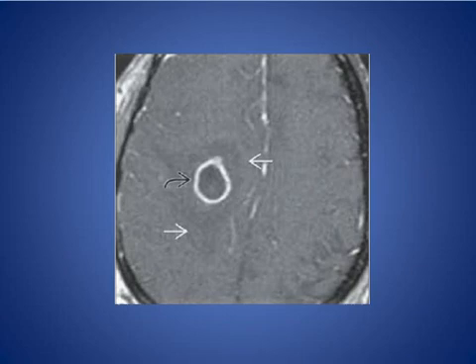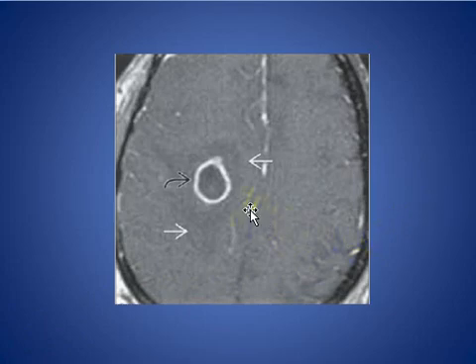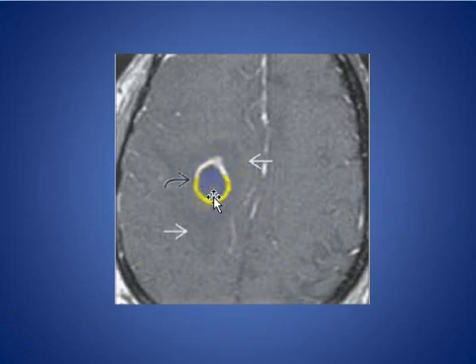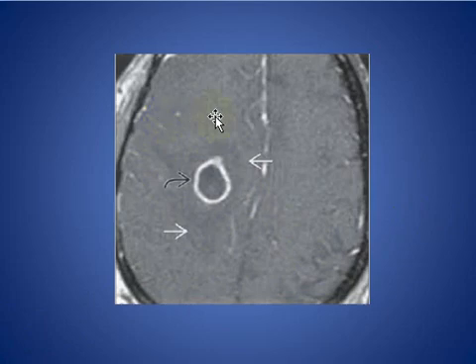Here we see on this axial MRI image a solitary ring-enhancing mass lesion with necrosis, smooth outline, and vasogenic edema — characteristic of a pyogenic abscess.